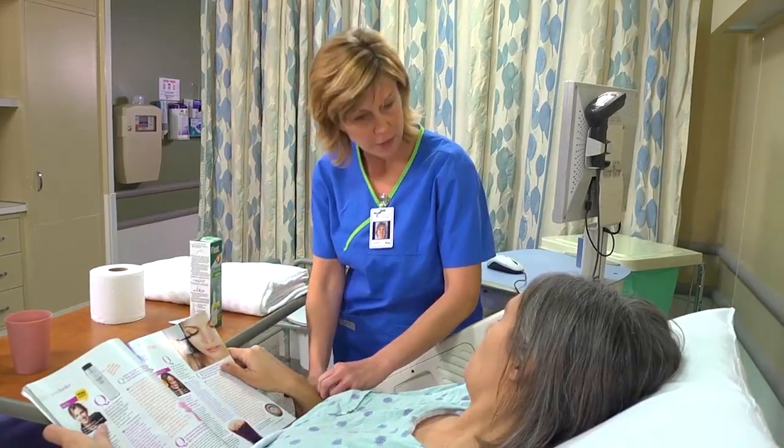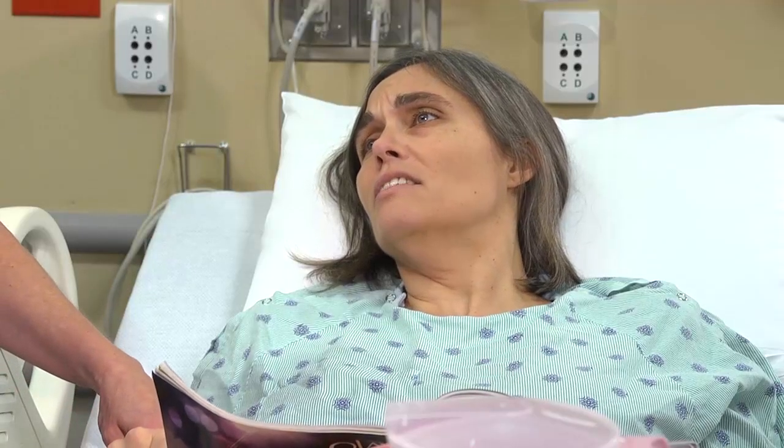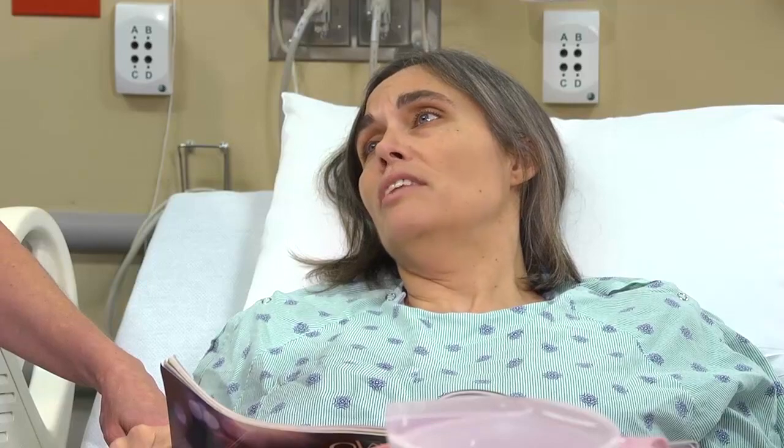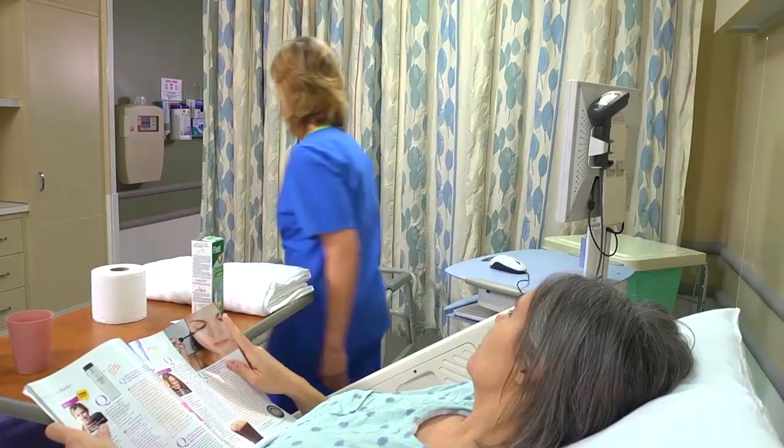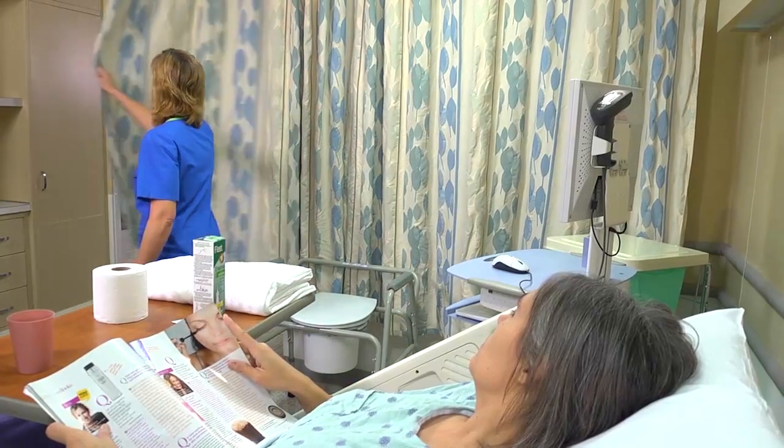All right, if you could state your name for me, please. Joanna Hankins. And your birthday? 7470. Okay, I'm going to close the curtain for privacy for us. Provide privacy by drawing the bedside curtain or closing the door.